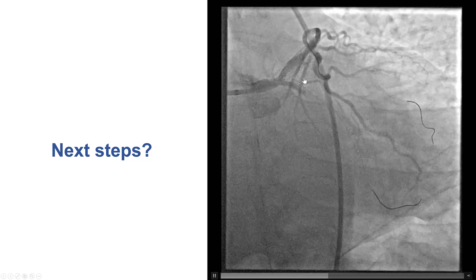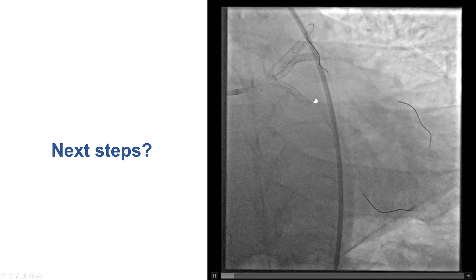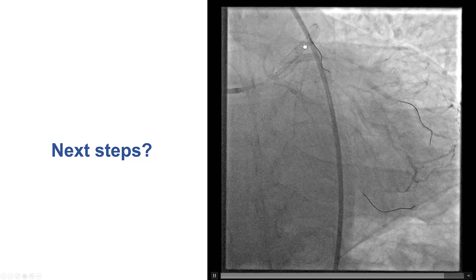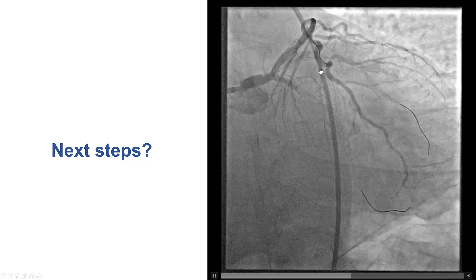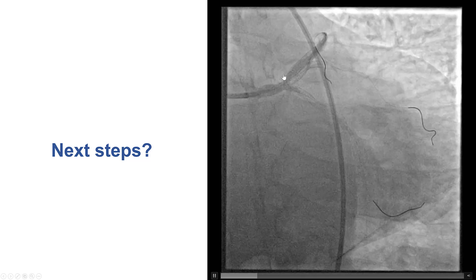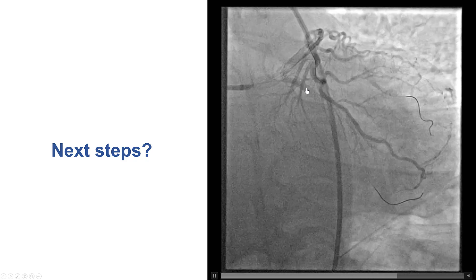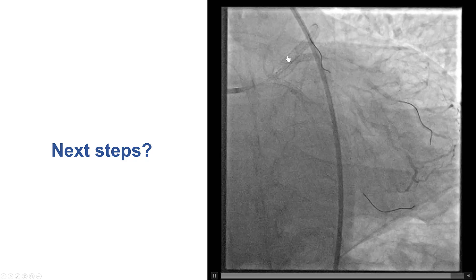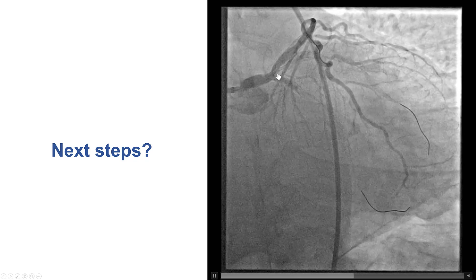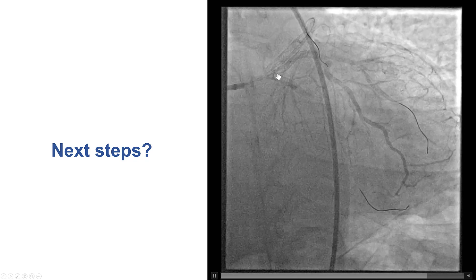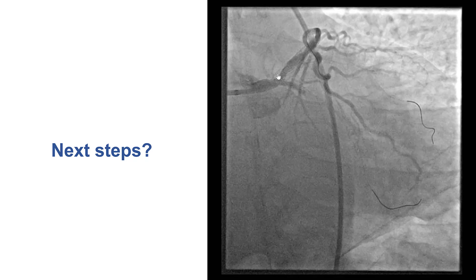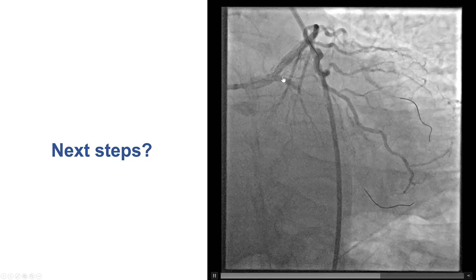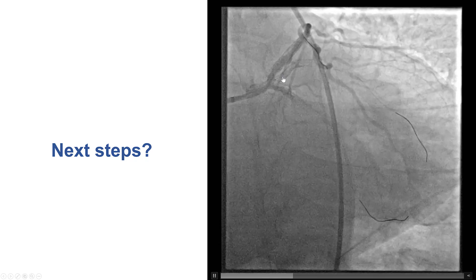We now have a wire into the ramus and a wire in the circumflex. It is very important to also place a wire in the LAD, because treating the thrombus in the other vessels may result in thrombus being pushed back into the patent vessel — the LAD in our case — which could have catastrophic consequences. Securing wire access in that vessel facilitates treatment if such a problem occurs.